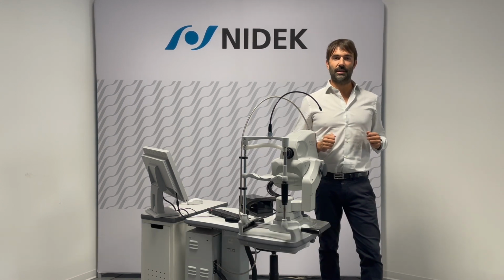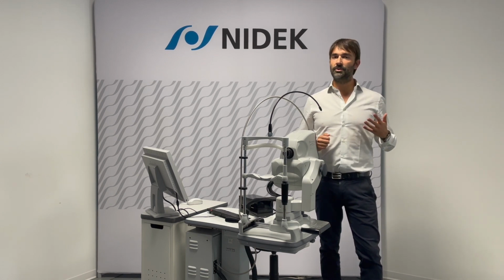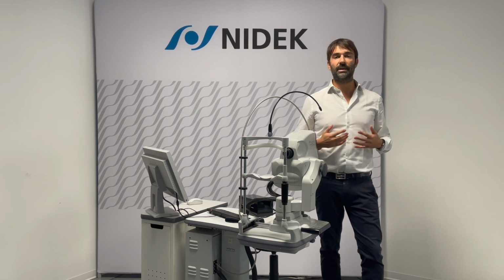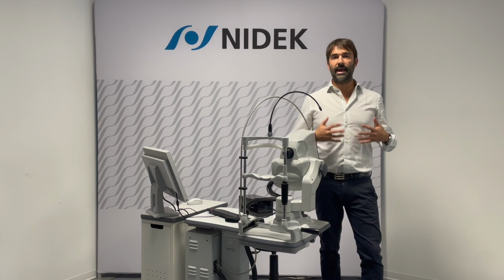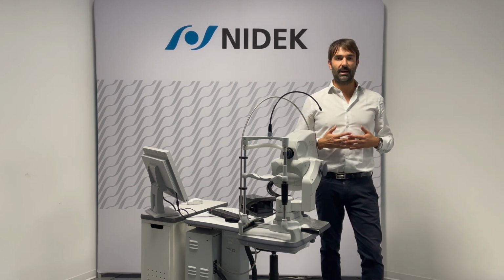I work for NIDEK International Division and I'm in charge of retinal imaging products. Today, I'd like to introduce you to NIDEK Mirante, which in my opinion is the pinnacle of more than a decade developing high-quality retinal imaging technologies. Now, finally fully integrated into one single, powerful multimodal imaging platform. So let me show you what Mirante does and how it works.